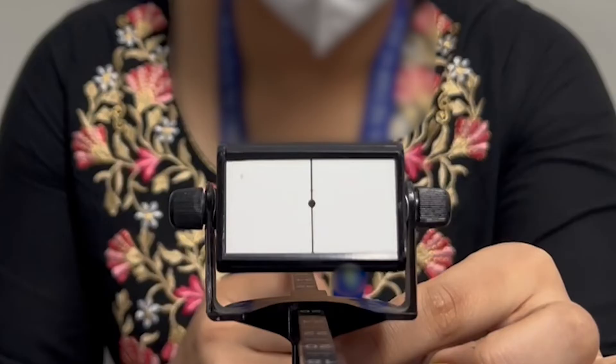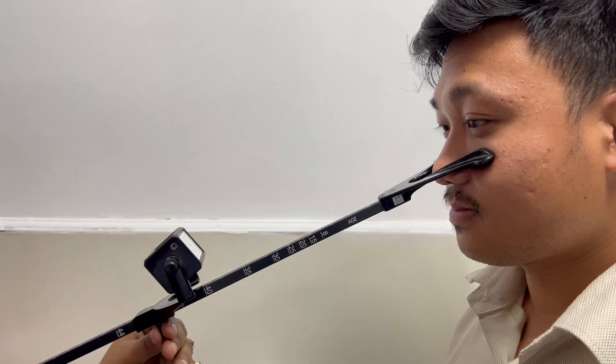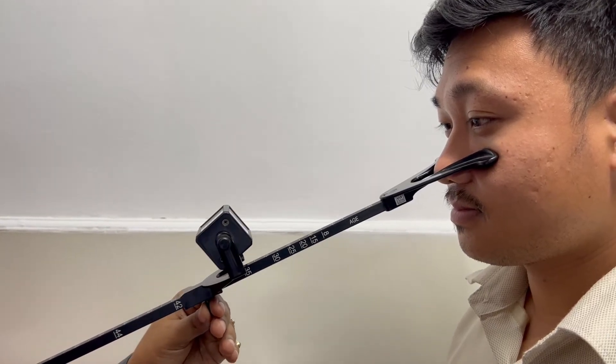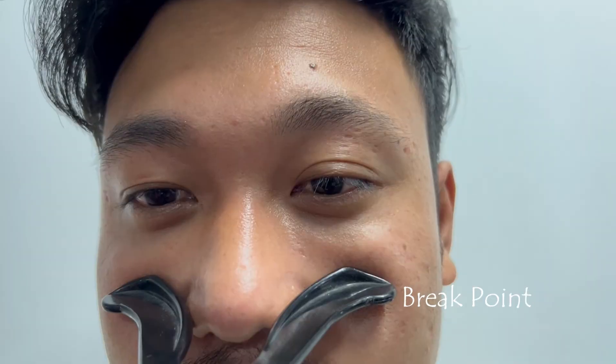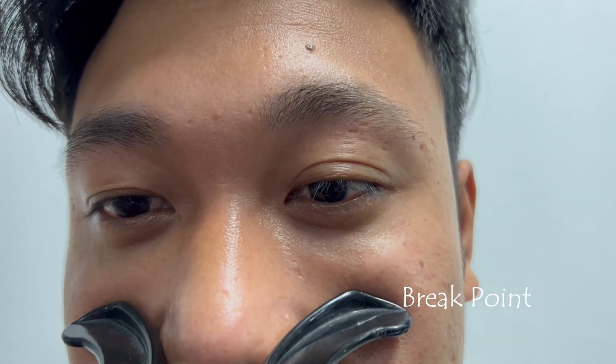Examiner asks the patient to focus on the black dot and slowly moves the target towards the patient's eyes at a constant linear speed. The subjective break point is indicated when the patient either reports diplopia or until the slider is stopped by the cheek rest.